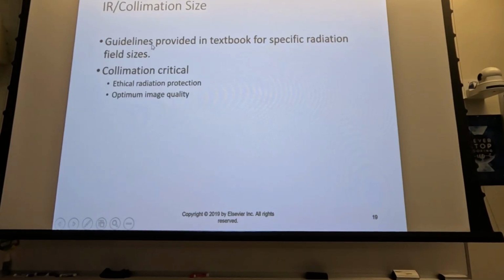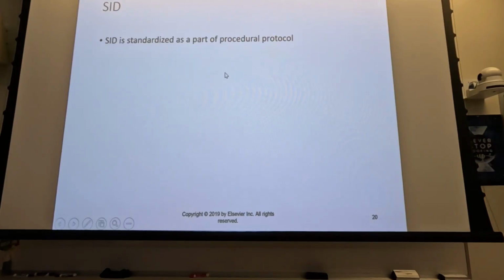You're going to see that the positioning in the textbook is for ideal patients. If they were ideal patients, they wouldn't be in the ER. So collimation is very important. Make sure that you get your collimation.